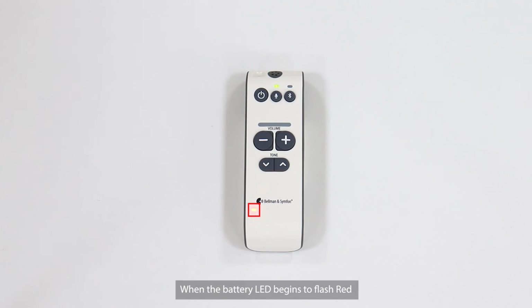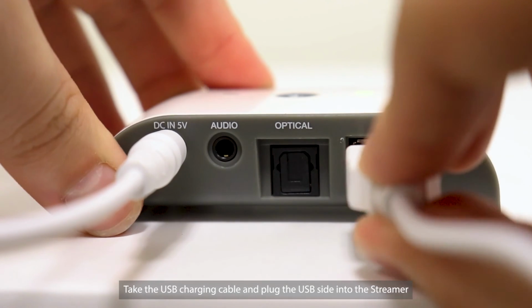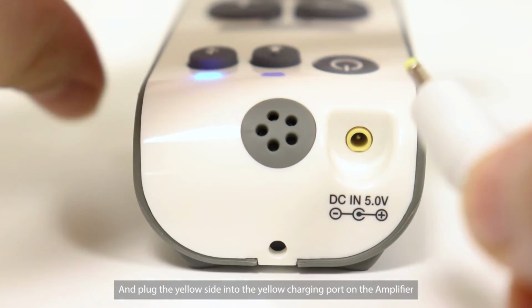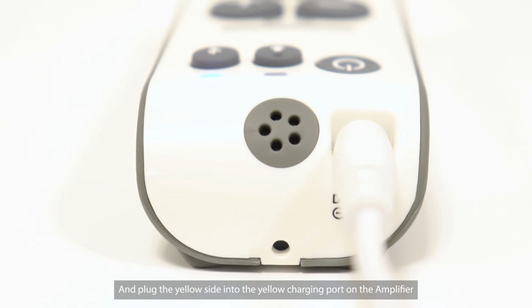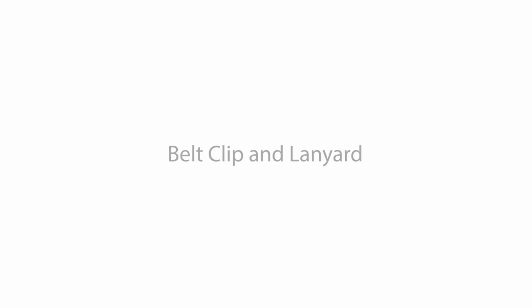When the battery LED begins to flash red, that means the battery is low and it needs to be charged. Take the USB charging cable and plug the USB side into the streamer, and plug the yellow side into the yellow charging port on the amplifier. The battery LED will begin to flash green to indicate it's charging. A steady green LED indicates the charging is finished.